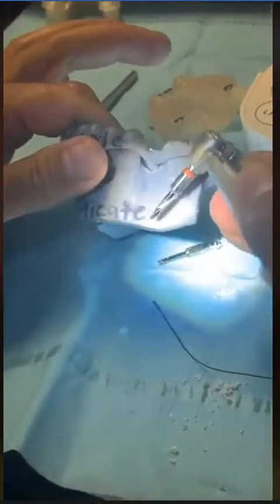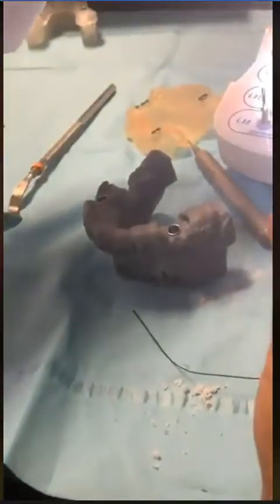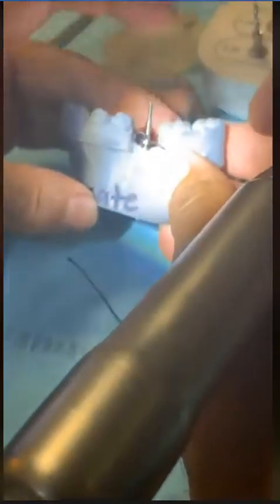The reason you're not getting so much is because these models are not as solid as the patient's own bone. Just a quick check on the patient. Put the paralleling pin in there. Oh, perfect. Exactly the way I want it to be. Let's take a look at the model.